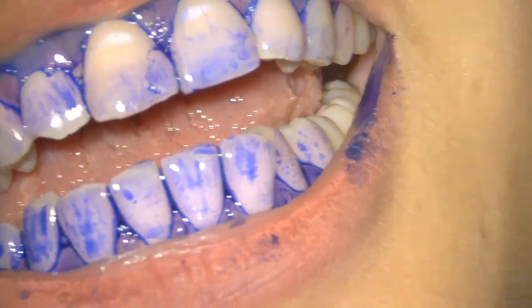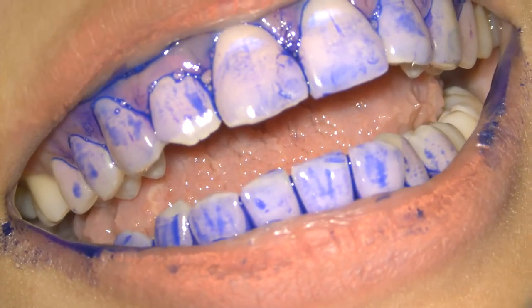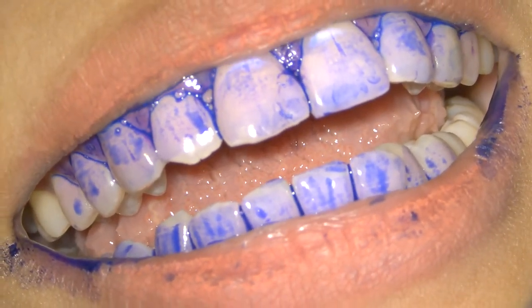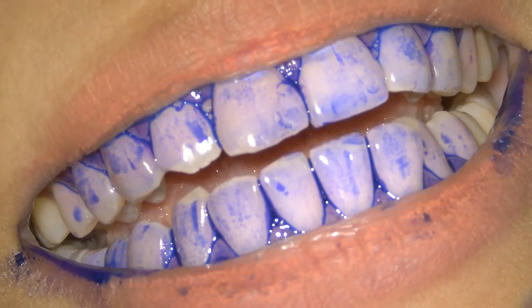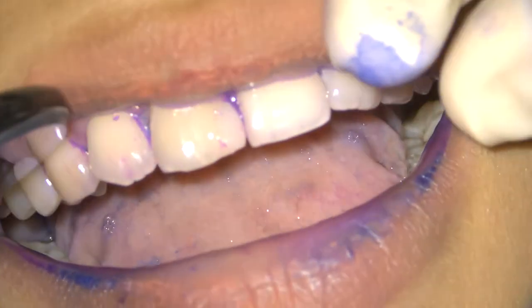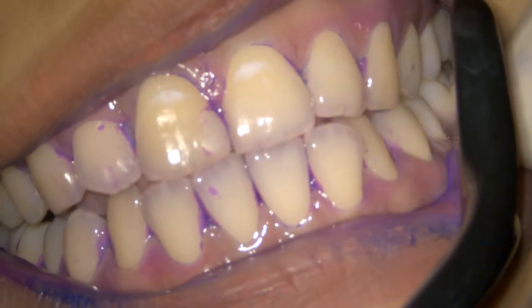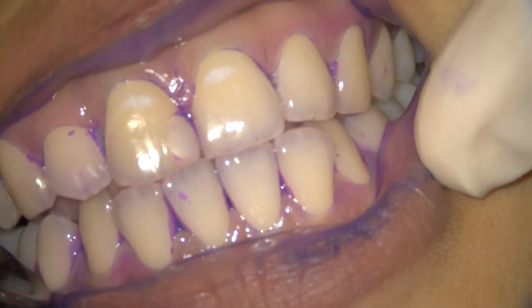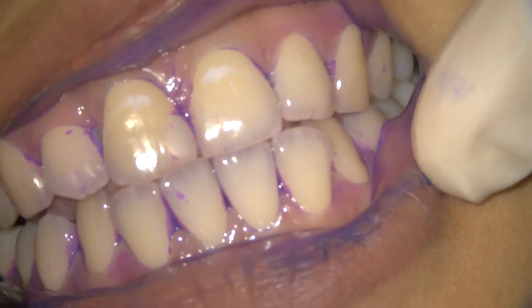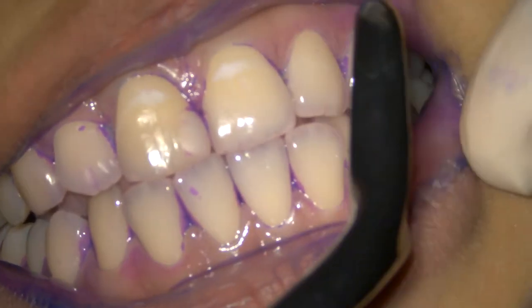Once you paint all the teeth surfaces and you want to score the plaque, you can ask the patient to rinse gently to remove the excess solution. Now you can see that we have finished applying the disclosing solution on all the teeth surfaces, and the patient has gently rinsed for less than 10 seconds. After that you observe.